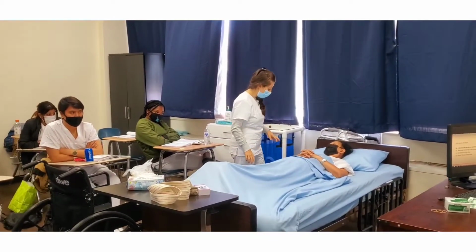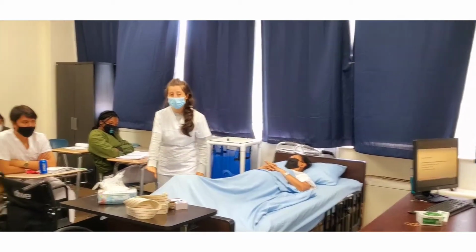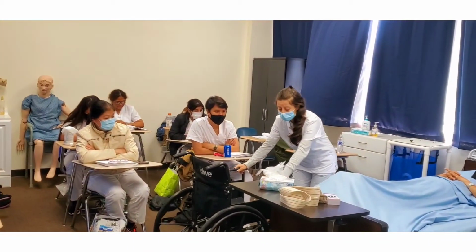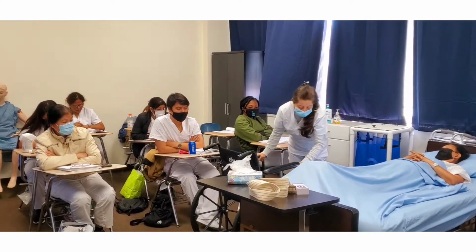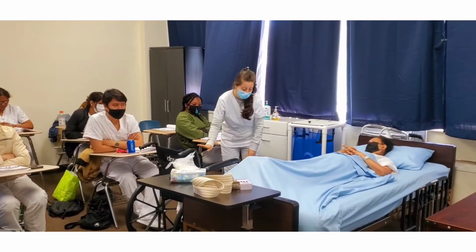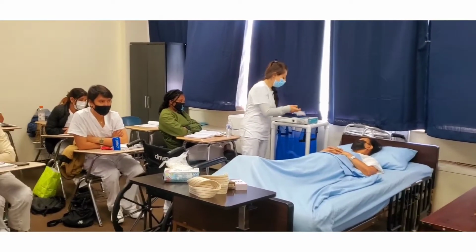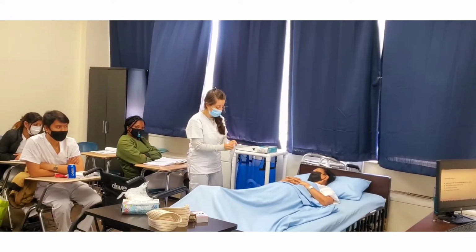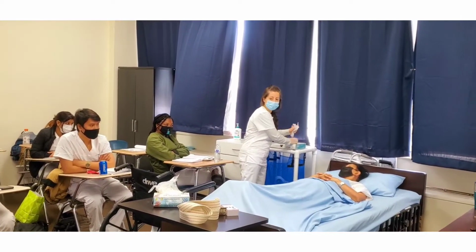I'm going to make sure that the bed is in the lowest position, that the bed wheels are locked, and that the wheelchair is locked as well. So I'm just going to move it a little bit closer for us, right here. I want to use gloves for this procedure, just for safety purposes, but it's totally up to you as long as you have disinfected your hands.